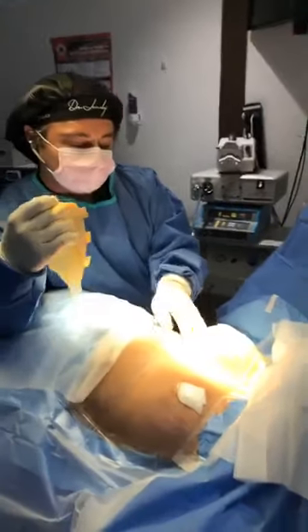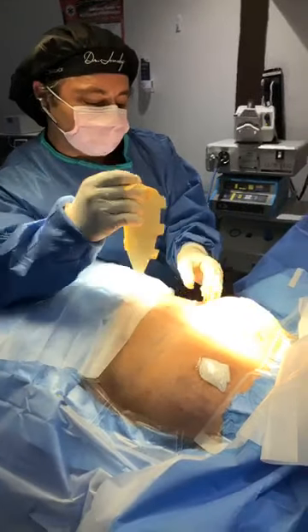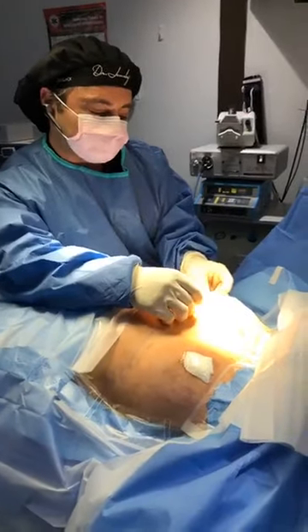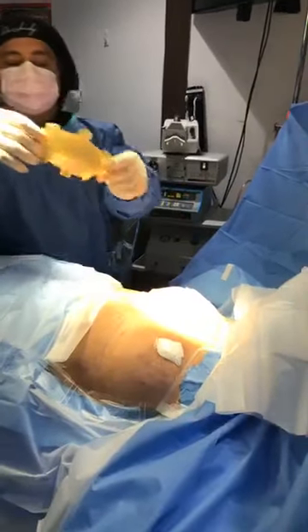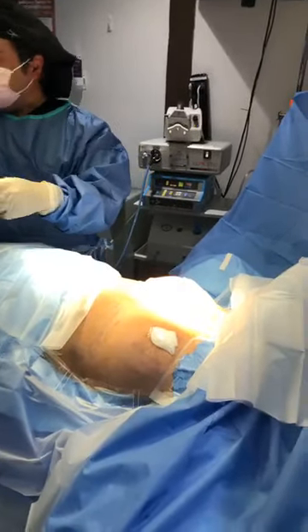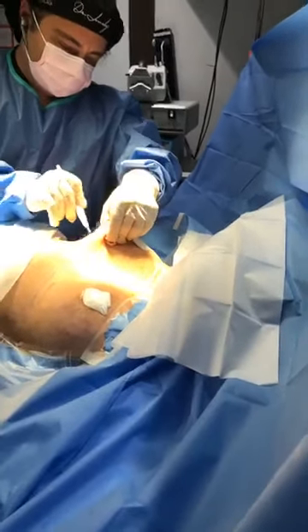Today we're going to be lifting the breast. She had a prior breast implant placed somewhere else. We're going to be putting in an internal bra which will lift the breast and hold it into place, called a Galashape bra. I'm going to show you how this is done.